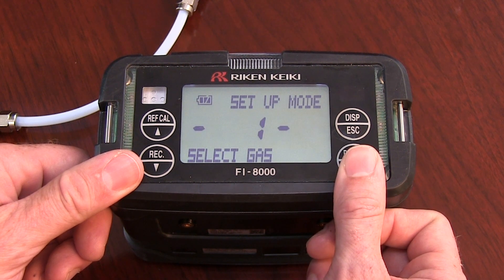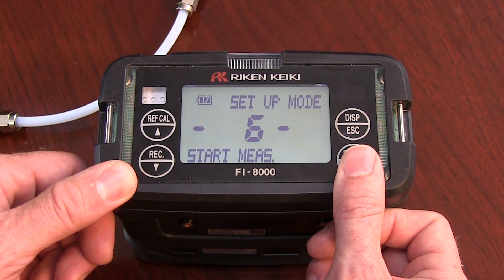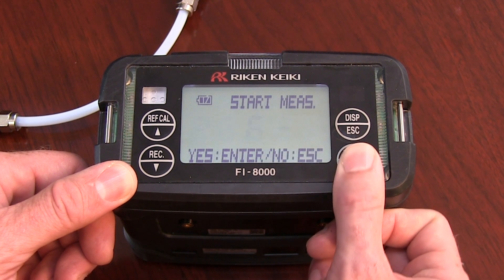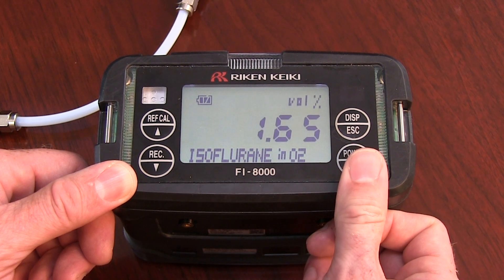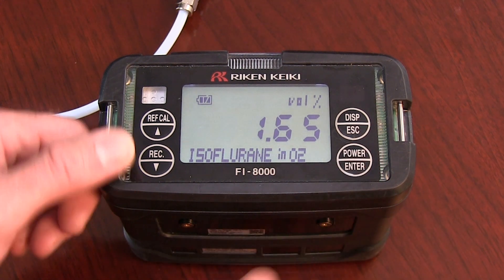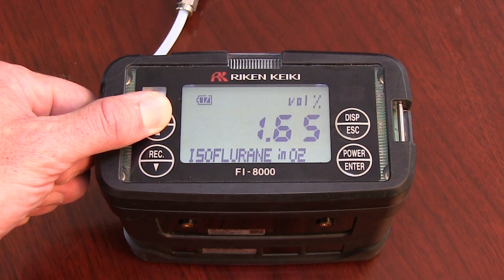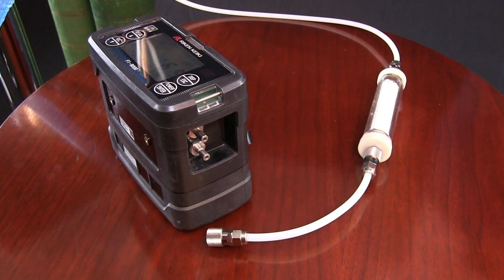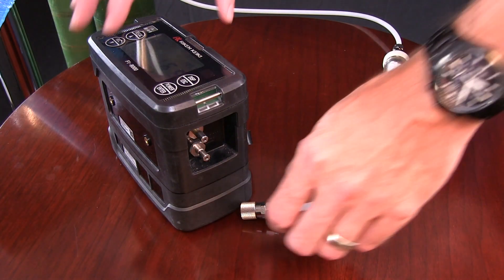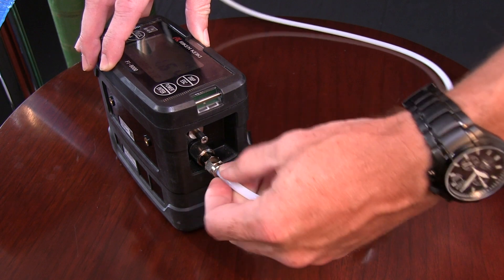From the main menu, navigate to Option 6: Start Measure. The fastest way is to press the Rec Down button from Option 1, then press Power Enter. The FI-8000P will prompt you to confirm your selection — press Enter to confirm or Escape to return to the main menu. The LCD will now display the AirCal level at 1.65% and isoflurane in O2. To set the AirCal value, press and hold the RefCal Up arrow button until it beeps to confirm. To connect the sample line, locate the Gas-In connection on the right side of the unit and securely attach the Quick-Connect.